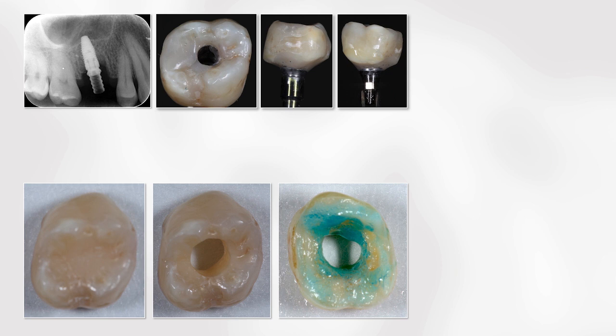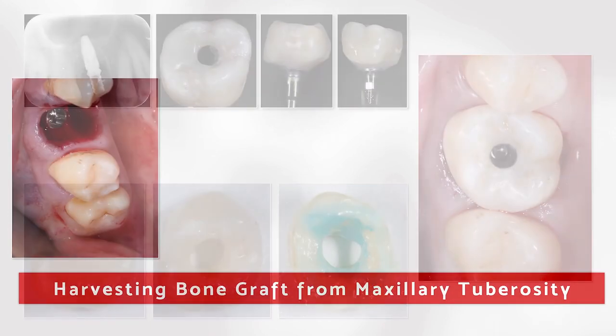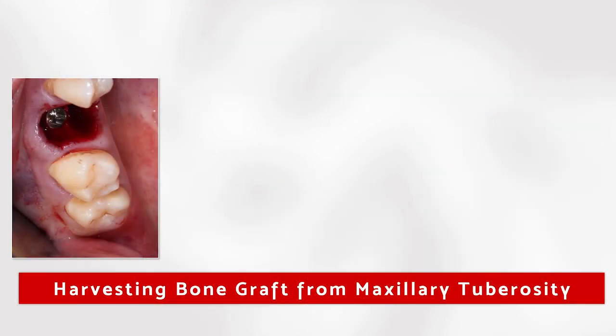We open a hole exactly in the center of the crown. We etched and applied composite resin in increments. So we reline the cervical area of this provisional restoration using composite resin. We check this provisional restoration onto the implant, and after that, we went to the next step.